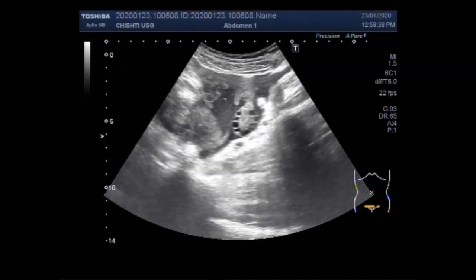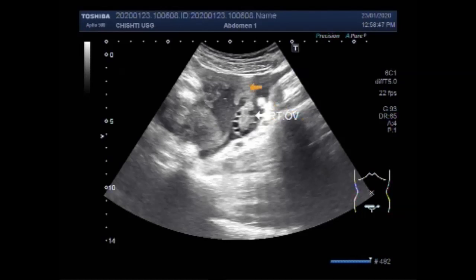Here again is the right ovary. This is the right fallopian tube. You can see the thick fluid seen around the ovary and the fallopian tube.